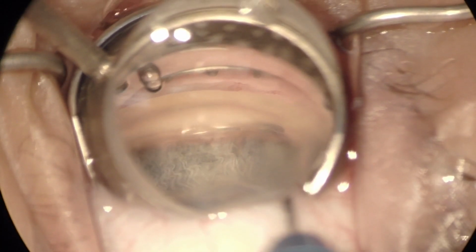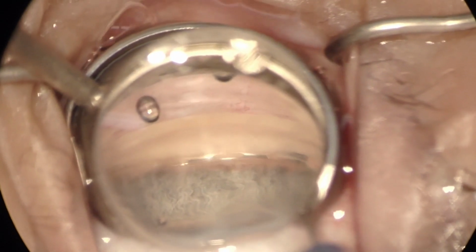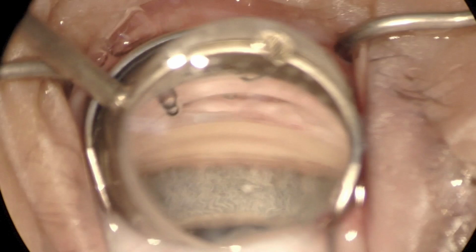And this is a case where I'm starting to deploy the stent, but it starts to dive a little bit posterior. If you watch that leading edge on the left-hand side, you can see it dips down and goes behind the iris root. So instead of continuing, I just retract back and we'll move to a new spot and deploy that stent. That's one thing you want to watch with this device, is that it can dive a little bit posterior if you don't have that proper starting position and you're not in a good position in the canal.